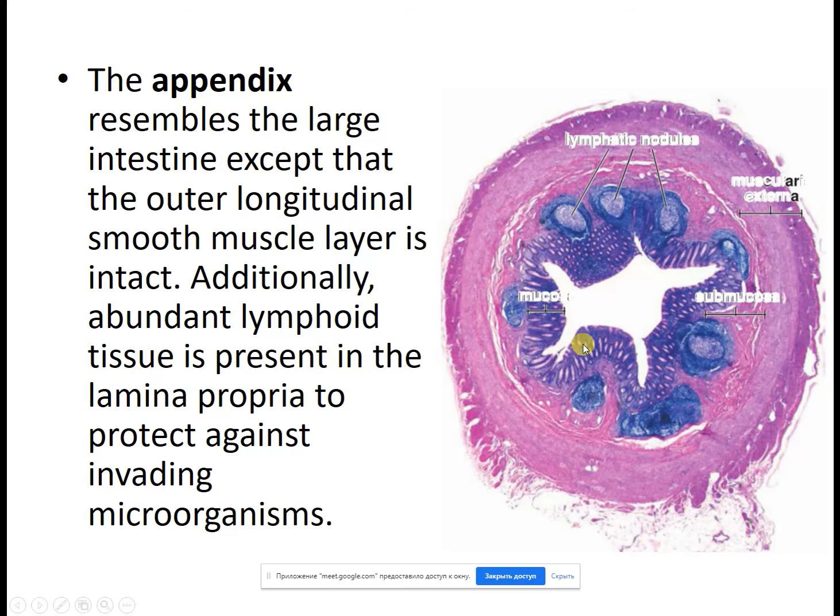Superficially we have the usual epithelium, which is not very pale, but deeper down you see very pale glands, pale because of mucus collected there. Goblet cells collect mucus, and that's why they look pale in a histological view, because mucus cannot be stained with conventional dyes.